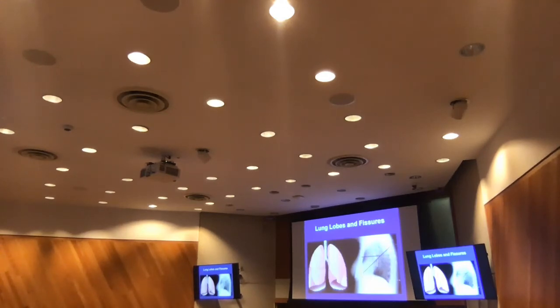First by the major fissure, also called the oblique fissure. Why? Because it is oblique. And a horizontal minor fissure will separate upper from middle. What is this lobe? Upper, middle lobe. You need the lateral view of the X-ray to know exactly where the upper lobe ends and where the lower lobe starts. On the frontal view, the upper lobe is just upper, the middle lobe is just middle, yes, but what is above?